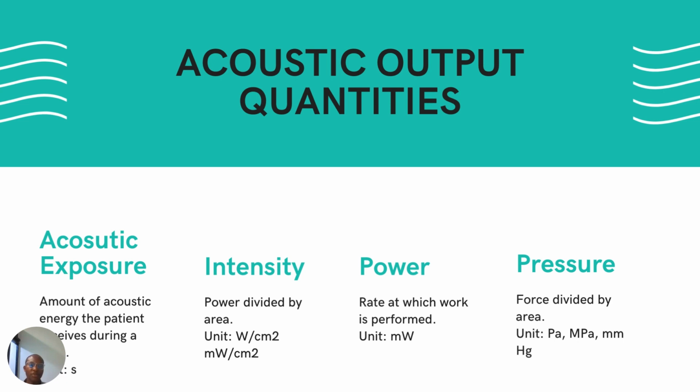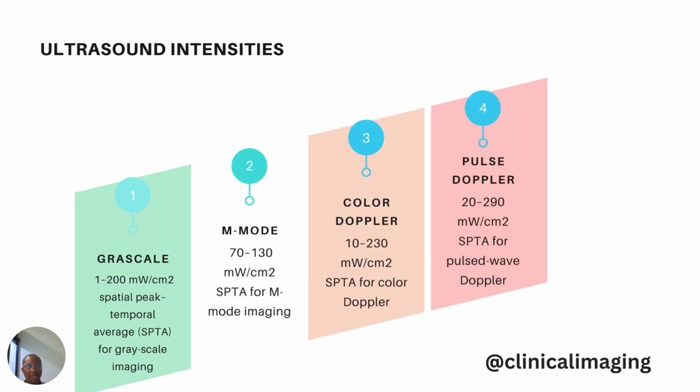Acoustic energy relates to all these acoustic output quantities. Out of all these, we are going to touch on intensity a little bit. In subsequent tutorials or lectures, I'm going to explain them one by one, because there are a lot of things that need to be done in order to do justice to each of these quantities. But for now, we are going to touch on intensity a little bit.